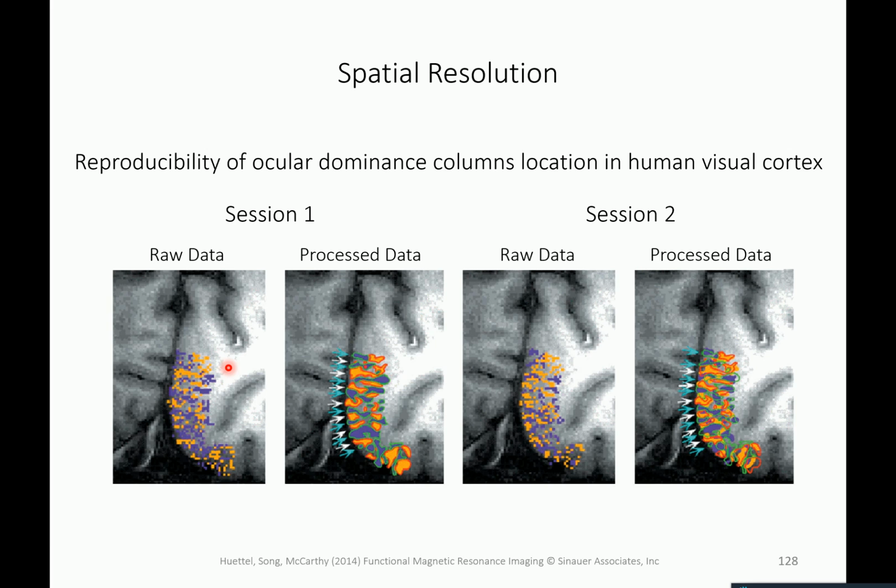They acquired a lot of data from a human participant who was really devoted to the whole project and held very still. I think this was done with a bite bar, so that there was no movement inside the scanner other than blood movement. They used really high-resolution imaging of visual cortex and presented left and right visual stimuli, most likely checkerboards, so that parts of primary visual cortex are primarily active for one eye and others for the other eye. Maybe they actually presented not to the left and right hemifield, but to one eye and the other eye, which you can do if you separate these things.